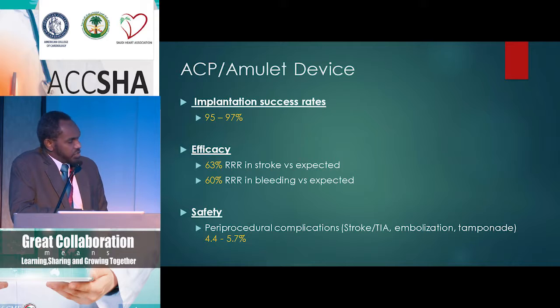Regarding the implantation success rates, fairly similar to the WATCHMAN, 95 to 97%. Efficacy: this device does not have prospective randomized controlled trials, so it does not compare the device to patients on Coumadin. It's basically registries where it's being compared to patients who are not able to take Coumadin. And the success rate of reducing stroke is basically a 63% relative risk reduction in stroke versus expected according to the CHA2DS2-VASc score, and 60% reduction in bleeding versus the expected according to the HAS-BLED score in the population.